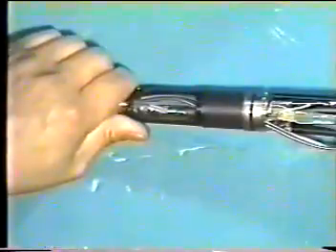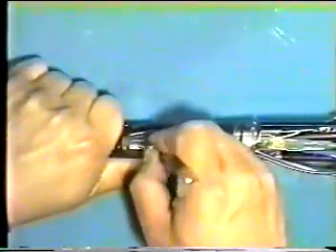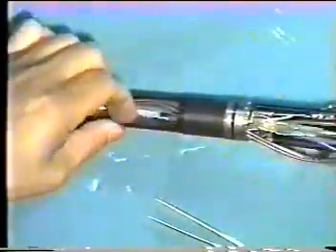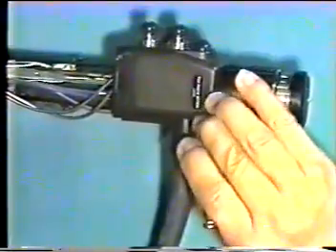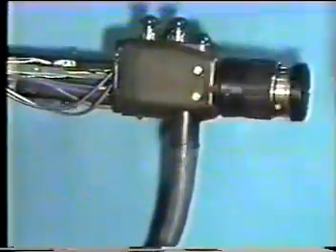Move the taper ring deliberately to take out FCT with no damage. Remove the sleeve and the taper ring from FCT. Peel off the nameplate, paying attention not to damage the side cover. Never apply such solution agent as ketone or something, as material of operating section is plastics.